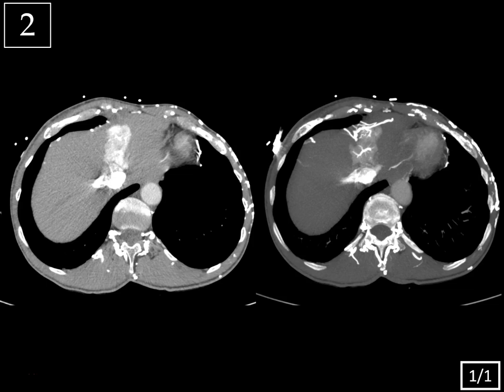Case two, slide one of one. This is a CT of the lung bases and upper abdomen. We're in the early arterial phase here in the upper abdomen, and you notice there's this patchy geographic hyperemia within the medial segment of the left lobe, also known as segment four. On this maximum intensity projection image on the right-hand side, you see collateral vessels entering into that area of patchy hyperemia, as well as extensive left chest wall collateral vessels and paraspinal vessels. Segment four of the liver is also known as the quadrate lobe — not to be confused with the caudate lobe, which is segment one.